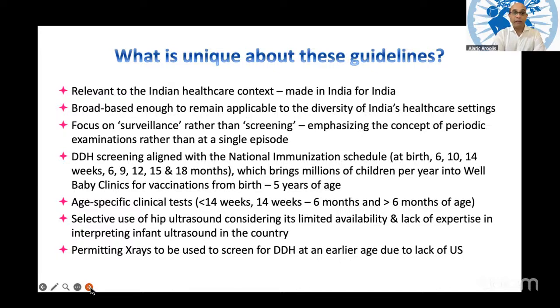We decided that we must use simple clinical tests to make it easy for people to understand and to elicit. And though we know that it's imperfect, and all around the world, people are moving towards universal hip ultrasound, we know for our country, it's not going to work as long as we have this very stringent PCPNDT Act. It's going to take some time before we can bring about an interest in ultrasound and how to interpret ultrasound. So we therefore decided to use the selective ultrasound screening.